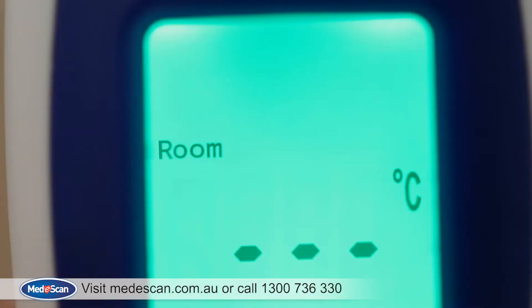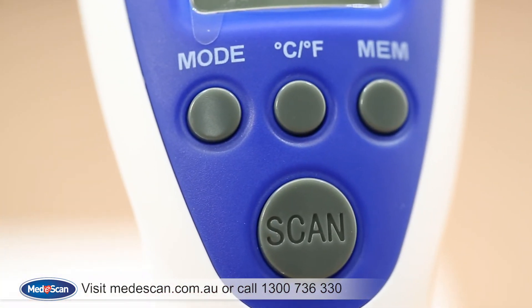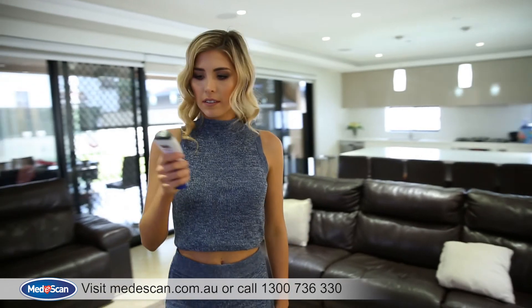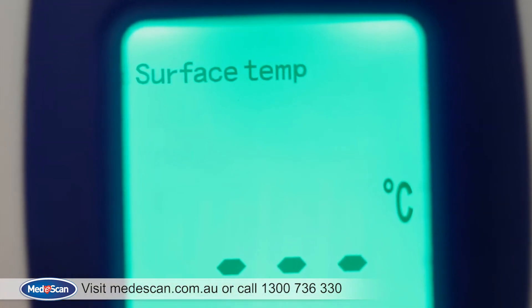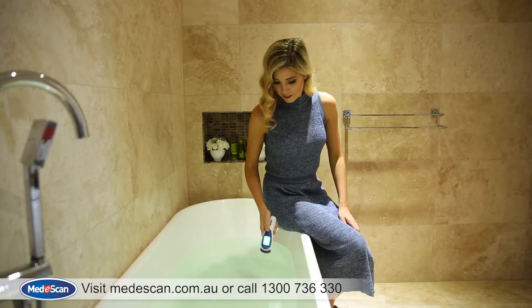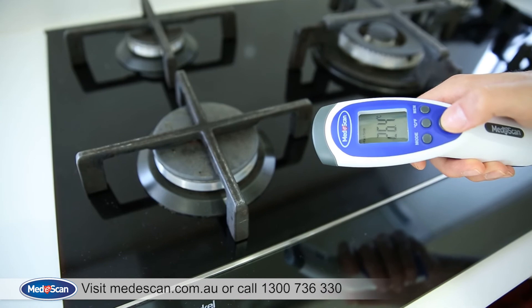The second mode is for measuring room temperature. Press the mode button to switch to room mode, then press the Scan button to measure room temperature. The last mode is the surface temperature mode — just point the thermometer within five centimetres from the surface you want to check and press Scan.